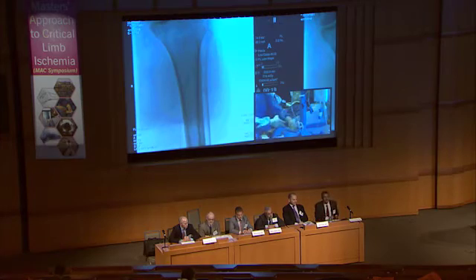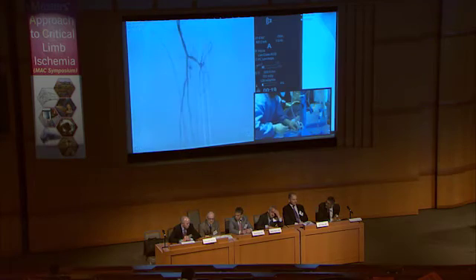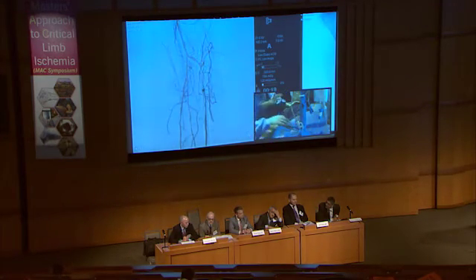Well, in theory, the angiosome concept is nice, provided you have a therapeutic option or modality which guarantees sufficient patency. At the moment, we don't. And what we have learned is the more arteries you open, the better the clinical longer-term outcome. So clearly, even if the result after chocolate balloon might look quite nice in the posterior tibial, I would approach the anterior because it's a pretty short occlusion. And if one of those vessels remains patent on the long term, this is clearly beneficial for the patient.